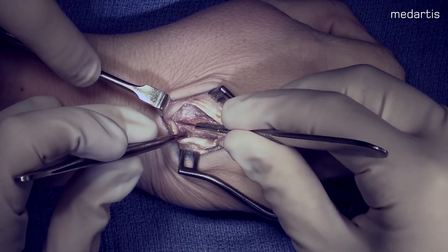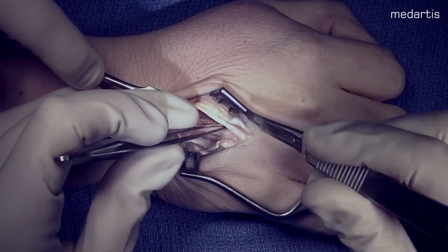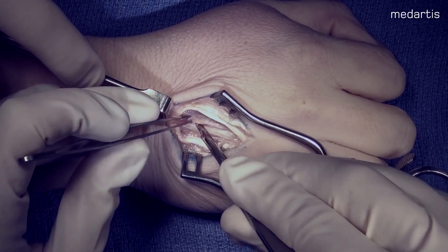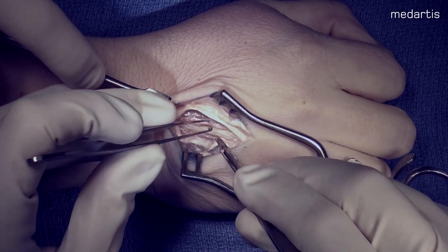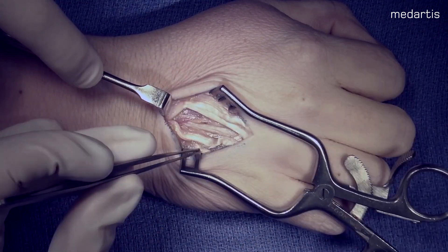We're going to elevate periosteal flaps in order to protect and plan for our osteotomy, with limited dissection of the dorsal interossei to preserve as much blood supply to the metacarpal as possible.